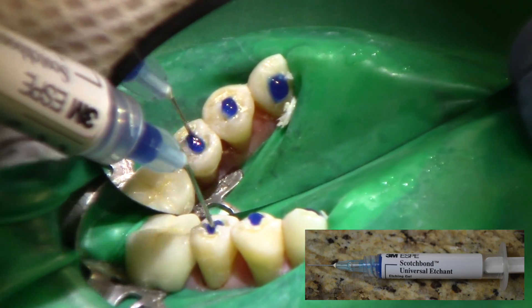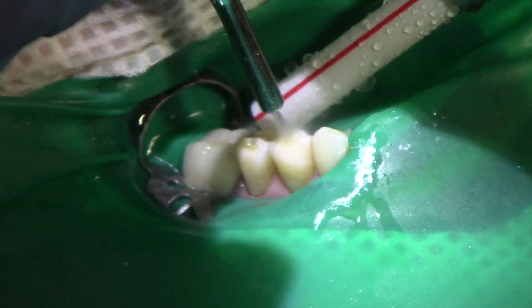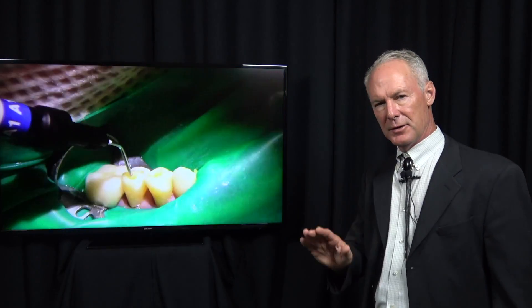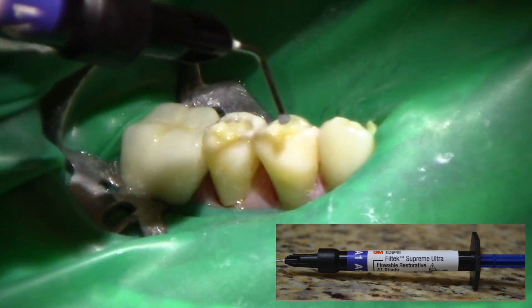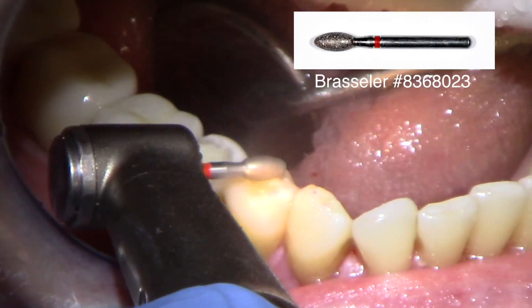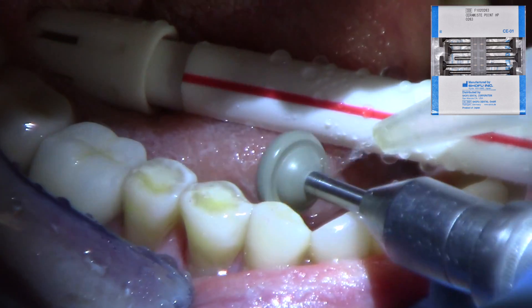Now these are all single-rooted teeth, so we're not going to place crowns on the teeth. This is 38% phosphoric acid, and this is primer adhesive. Place it copiously, then come back with your air syringe and blow the excess off into a two-by-two. Floss between the contacts, and always cure the primer adhesive before placing your final composite restoration. Now this is flowable composite — very good for small composite restorations. The ball burnisher. Cure each of those composites. Floss the teeth again. Check the occlusion. Then polish with either a round diamond or a football fine diamond. Shofu rubber wheel for final polish — lots of water.